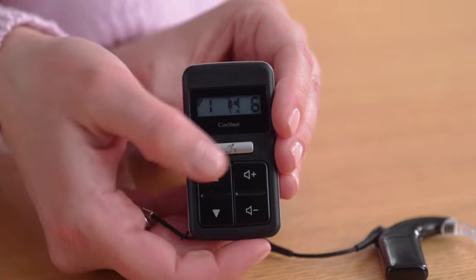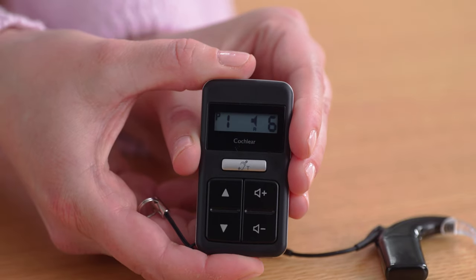If you have more than one accessory paired, press and hold again to select the next paired wireless accessory. To stop streaming, quick press the silver button to make the accessory icon disappear.